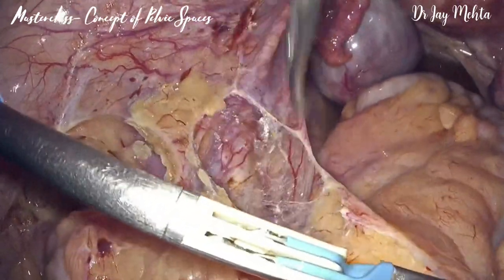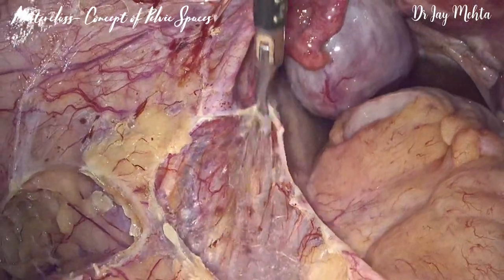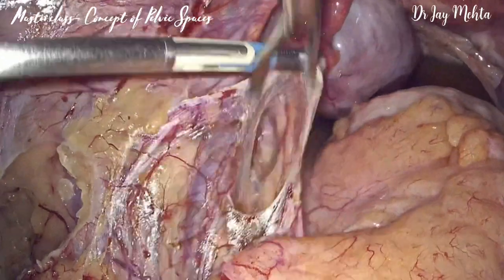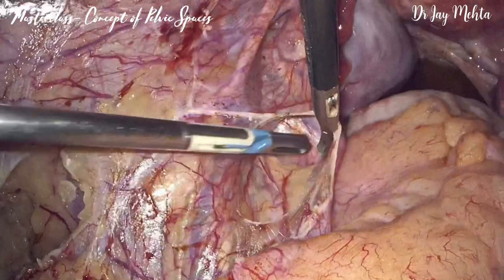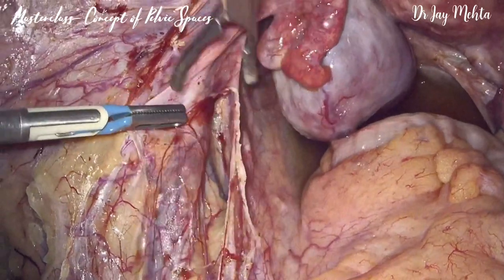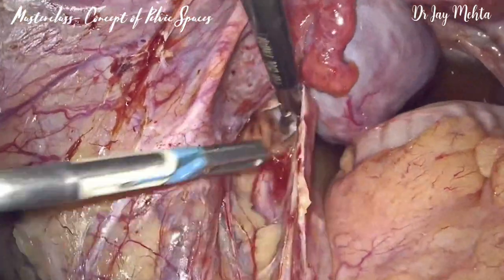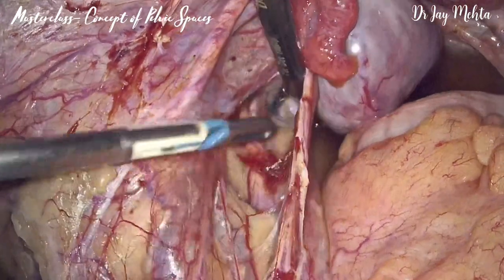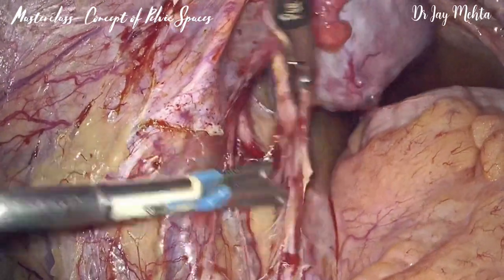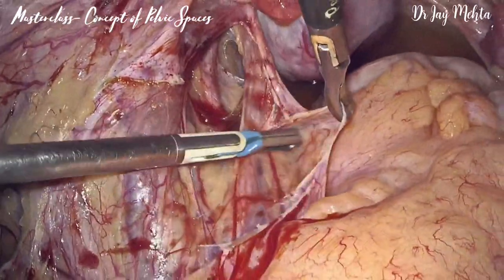Identify the infundibulopelvic ligament and tent the peritoneum up. The first structure you are going to identify by doing this maneuver is going to be the ureter. Always begin dissection of the pelvic spaces with the ureter in your mind. The minute the ureter goes lateral, the space which opens up medial to that is the pararectal space. The pararectal space is this entire compartment both medial and lateral to the ureter. In the pararectal space, the only structure that crosses from lateral to medial is the vascular parametrium — the uterine artery and uterine vein.